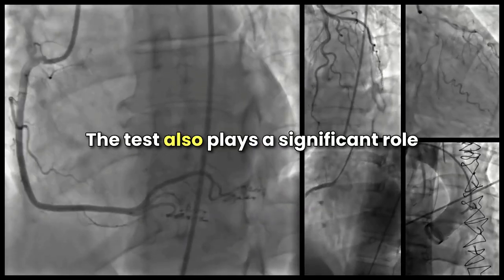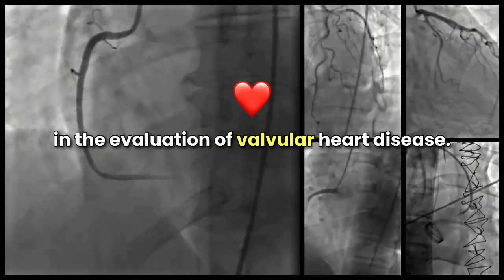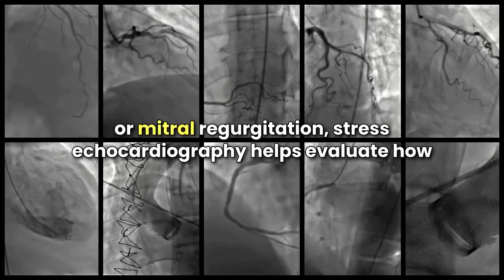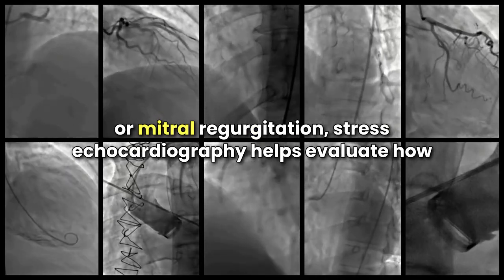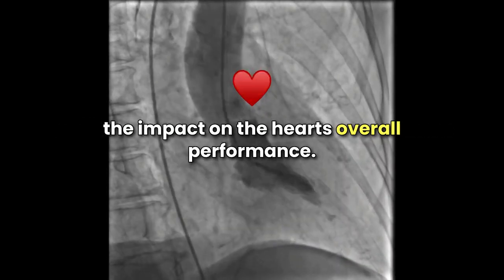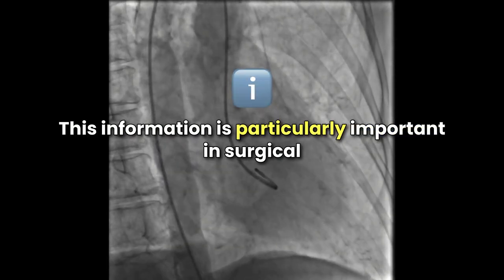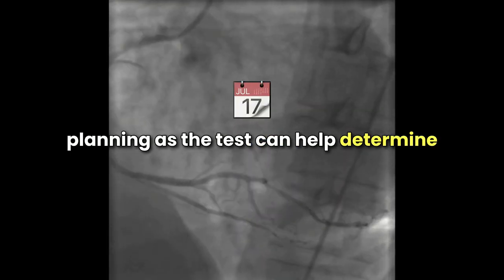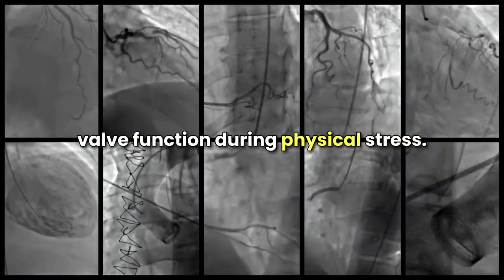The test also plays a significant role in the evaluation of valvular heart disease. For patients with known conditions like aortic stenosis or mitral regurgitation, stress echocardiography helps evaluate how well the heart valves function under stress and the impact on the heart's overall performance. This information is particularly important in surgical planning, as the test can help determine the need for valve surgery by assessing valve function during physical stress.